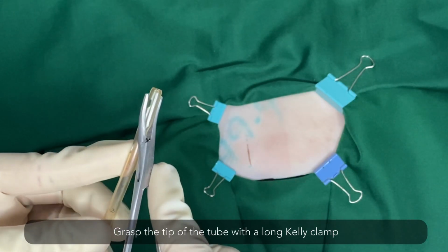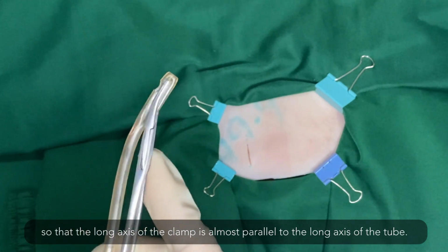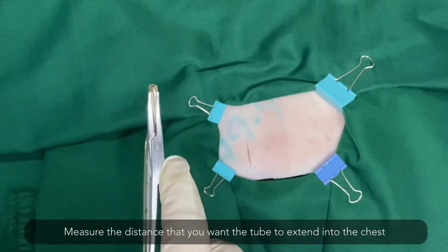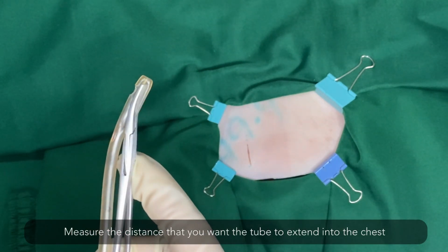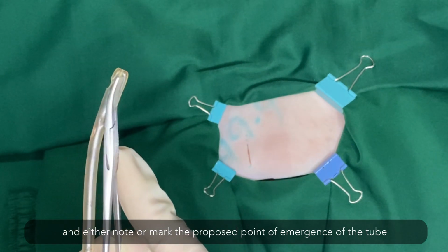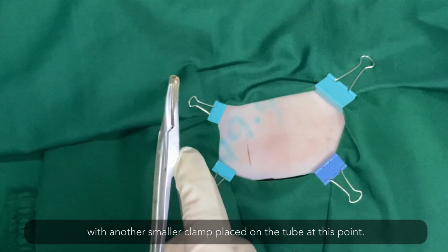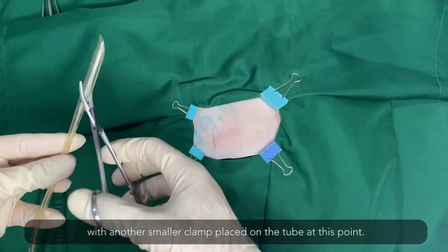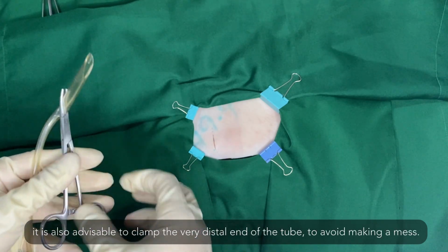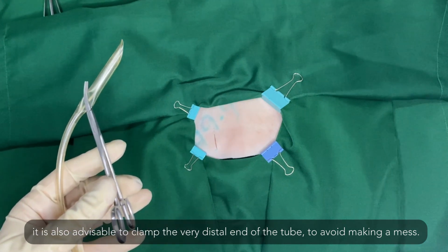Grasp the tip of the tube with a long Kelly clamp so that the long axis of the clamp is almost parallel to the long axis of the tube. Measure the distance that you want the tube to extend into the chest and either note or mark the proposed point of emergence of the tube with another smaller clamp placed on the tube at this point. If hemothorax is suspected, it is also advisable to clamp the very distal end of the tube to avoid making a mess.